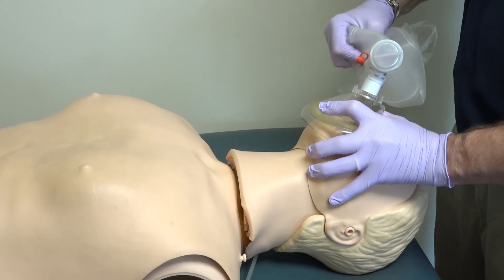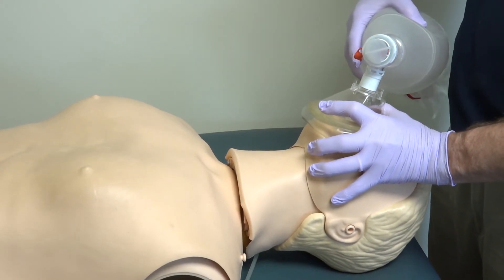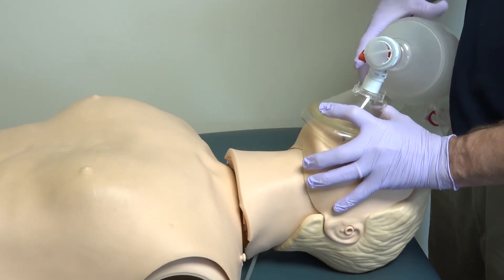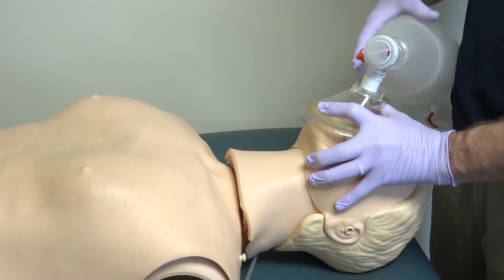Once this is completed, squeeze the bag. If done correctly, you will hear a breath and see a chest rise. If not correct, you will feel the air push back. The program will also give you feedback if you are giving sufficient air to the mannequin.